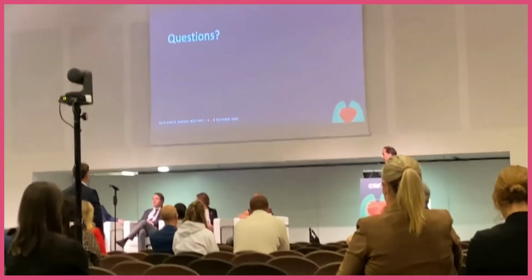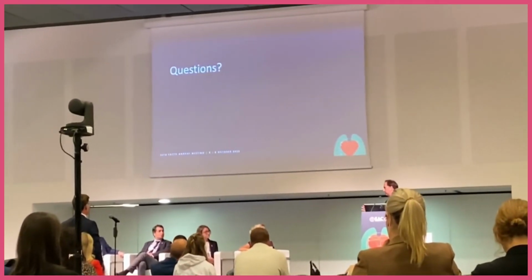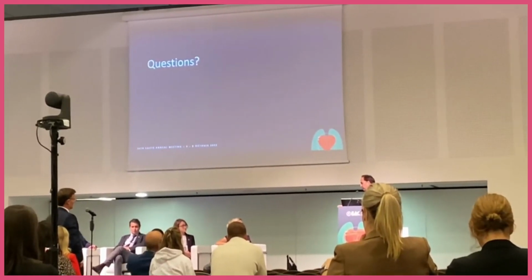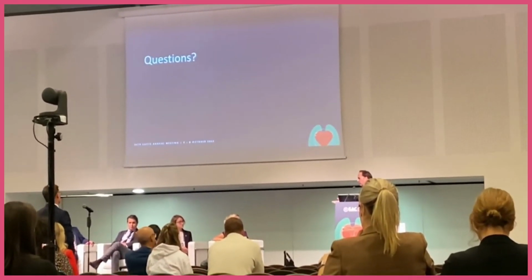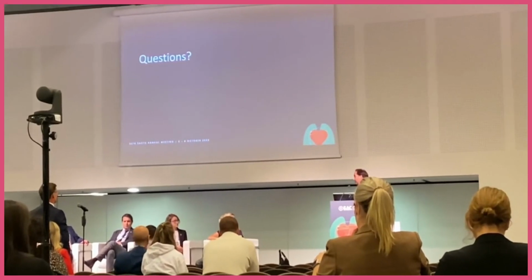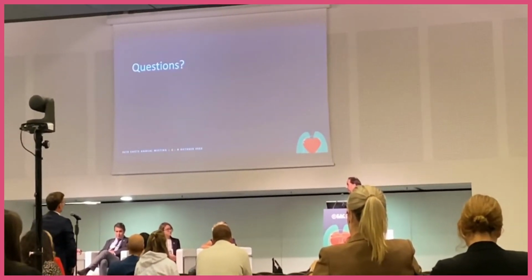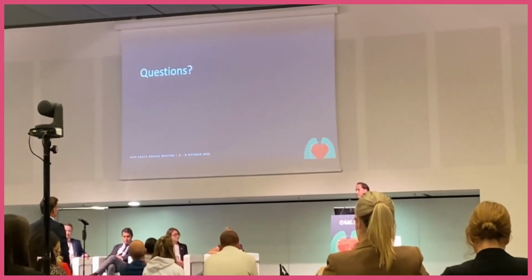And calcium? Can you cut through? No, you need to find a good landing zone. It's the same. Of course, you have a little bit more bailout when you do hand-sewn anastomosis. Of course, you can cut through some part of calcium. Preferably we'll shy away from that. So you have to find a nice landing area with a soft, normal vessel.